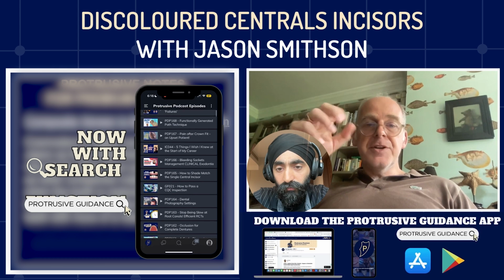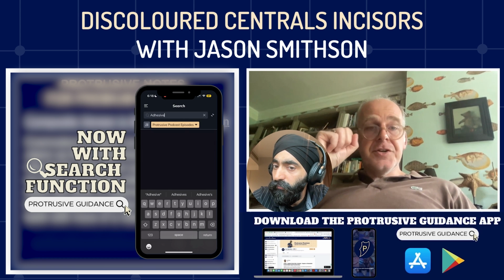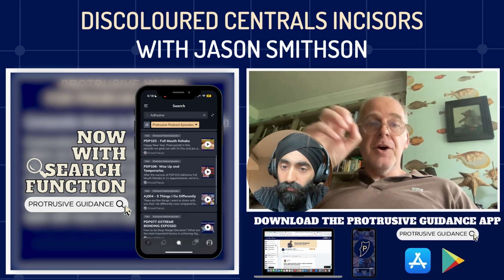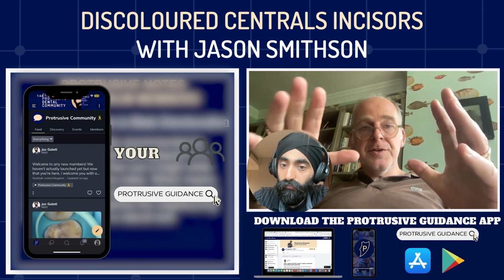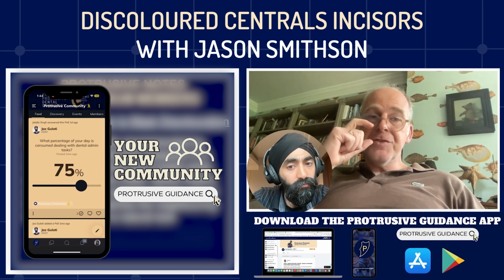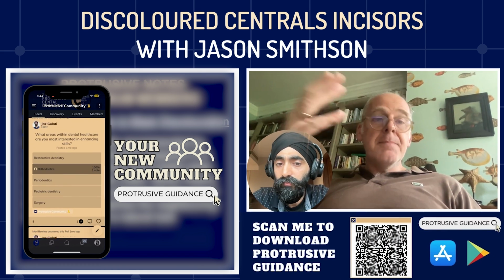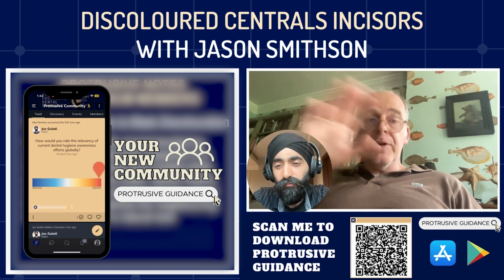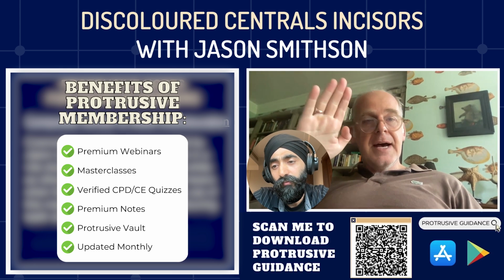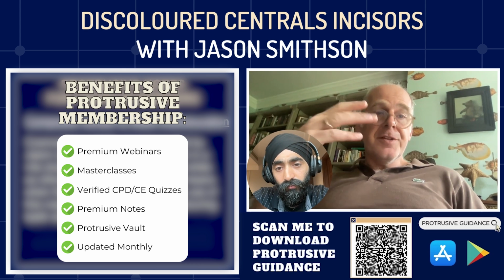Most companies have the opaquer, which is usually kind of white. And if you're not careful, you can end up losing chroma, losing color, and increasing value, increasing brightness on a discolored tooth, starting off with a tooth that's dark and low value, but ending up with a restoration that's too high value. So the restoration will really stand out and be too bright if you're not careful. Whereas with the Cosmodent ones, they have the A, B, C shades. So if you have, for example, surrounding teeth of A2, you would use Cosmodent's A2, A2.5 opaquer, and then the base shade, once you'd opaqued out the discoloration, would be A2, which makes it a lot more simple, rather than it being a bright white.